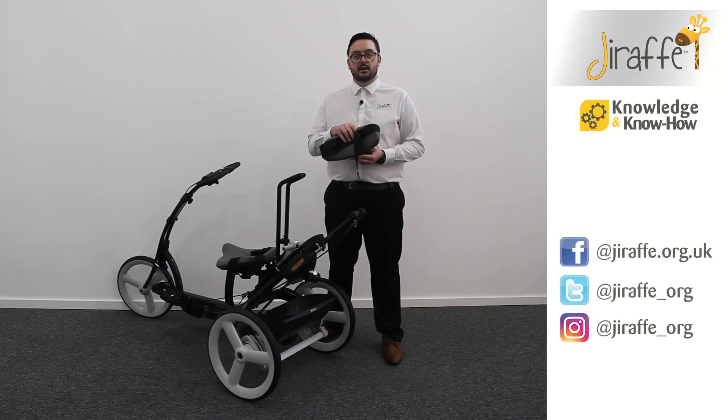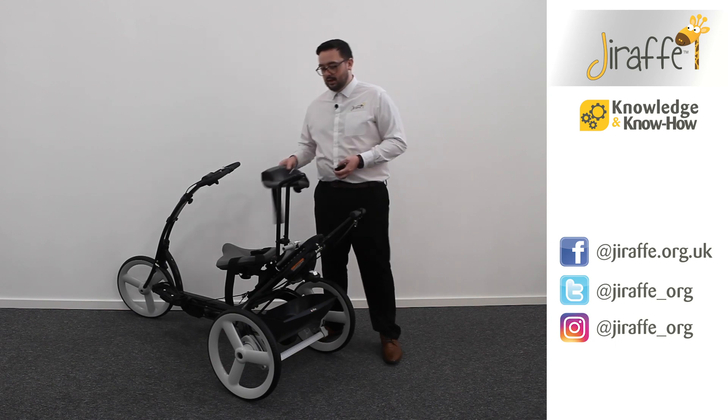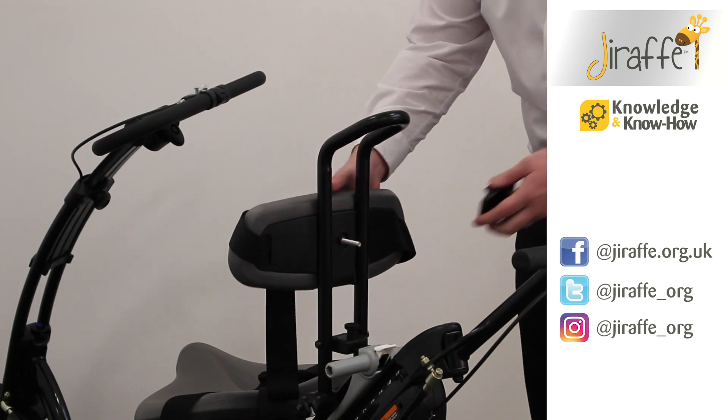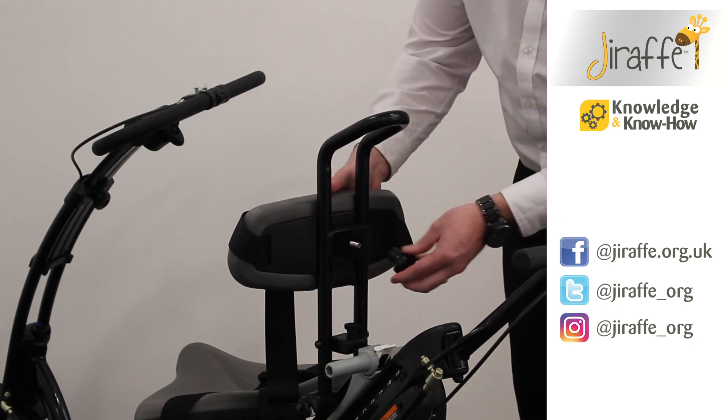The backrest pad can be an alternative to the trunk support system for users who need less trunk support and maybe just a simple sensory support around the trunk and waist. To attach the backrest pad, we just need to pop the bolt through the rear guide bars on the back of the tricycle, attach the rectangular clamp, and attach the wing knob.